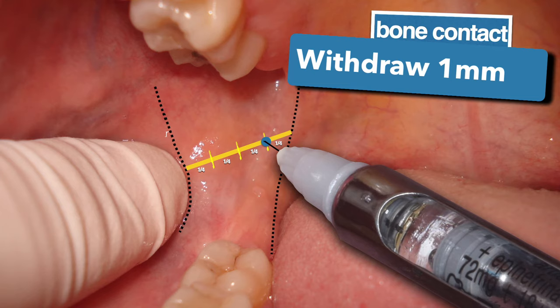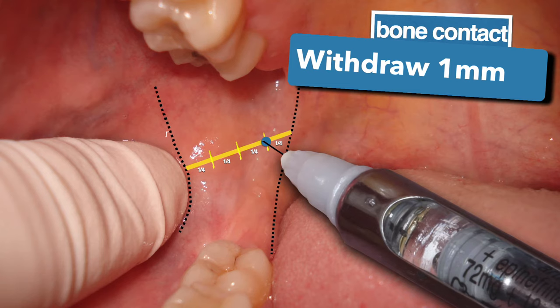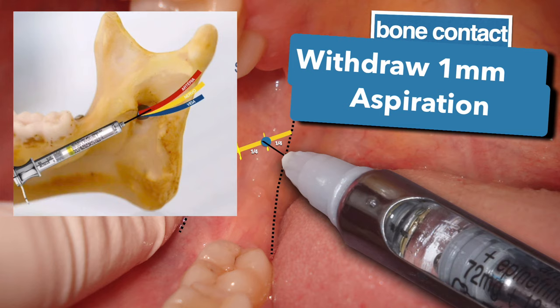After touching the bone, you will retract the needle about one millimeter. Why? To prevent the tip of the needle from being inside the mandibular foramen. Then you perform the aspiration maneuver to make sure that you are not inside any blood vessel or artery.